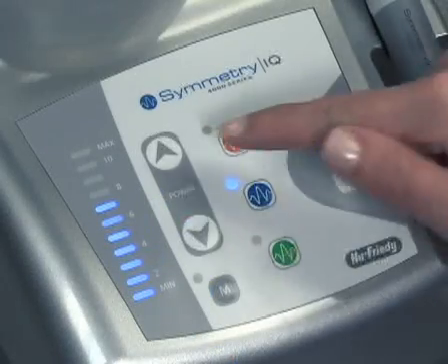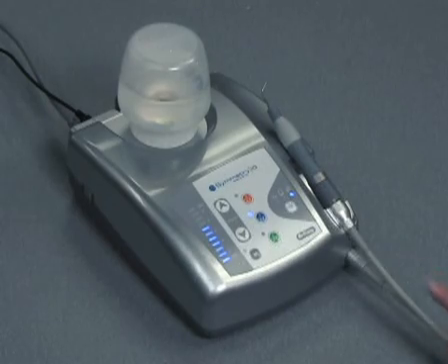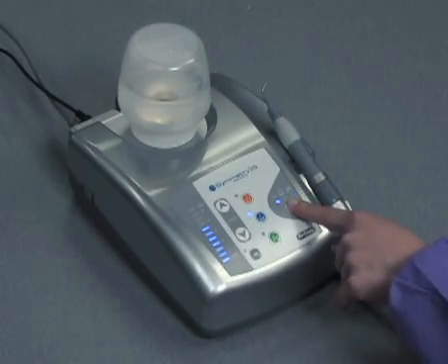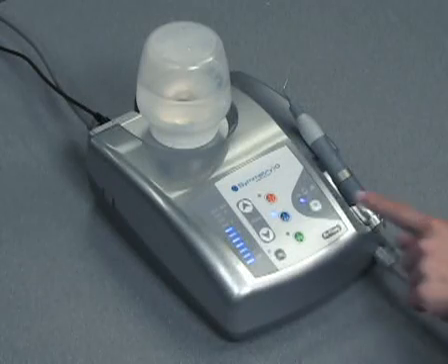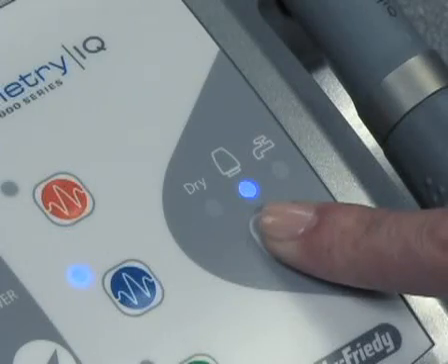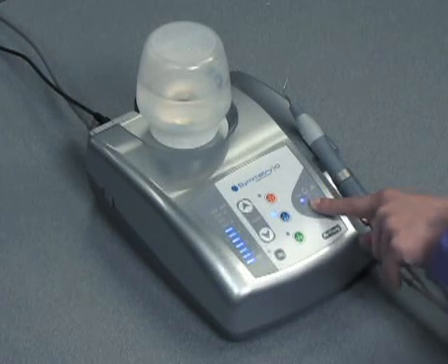Using a higher than recommended power setting may damage the tooth structure or the tip. Three water modes are available on the Symmetry IQ 4000 unit: irrigation bottle, municipal water, and dry mode. Simply press the water key on the control panel, indicated by a W, to move from one option to the next.